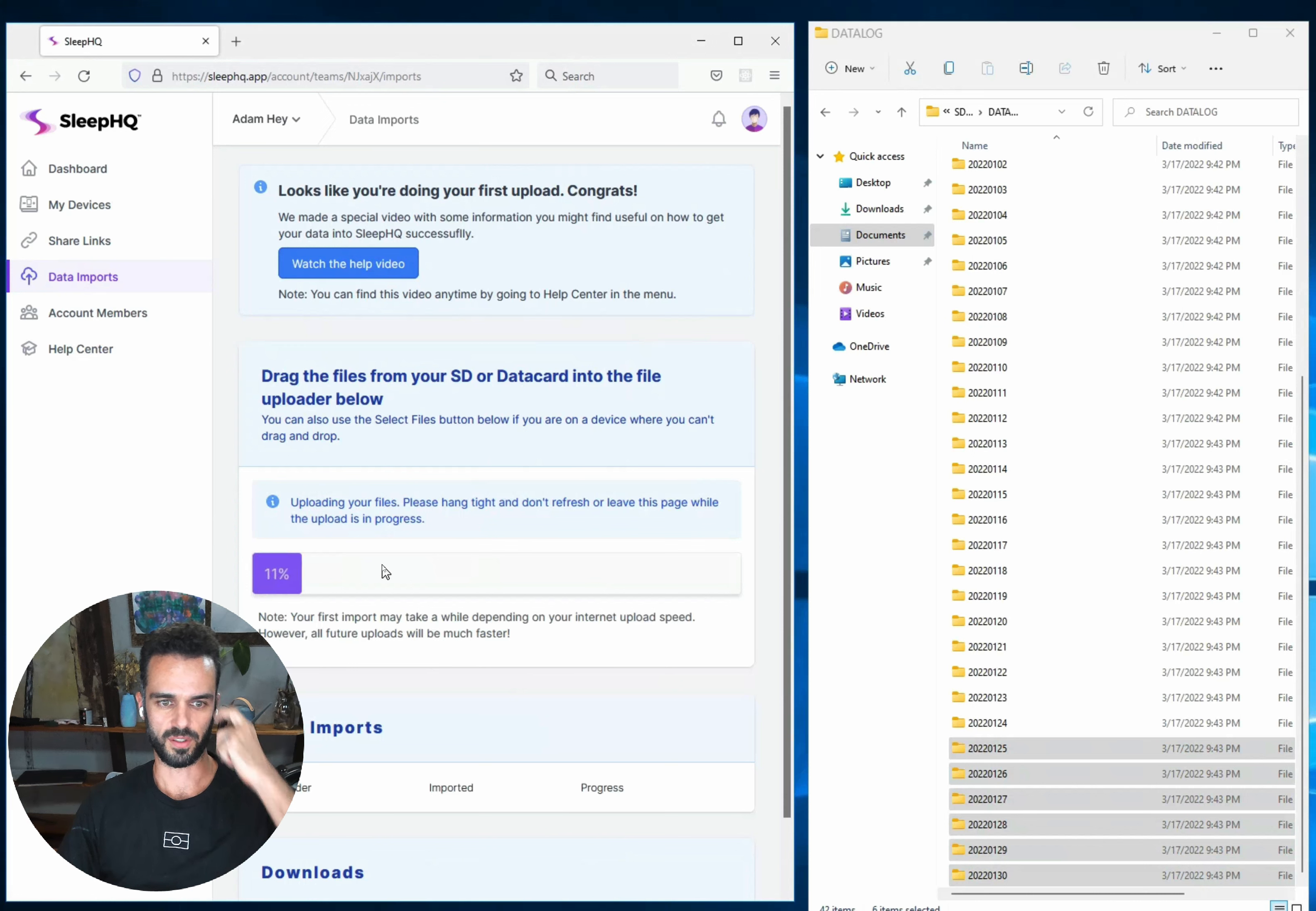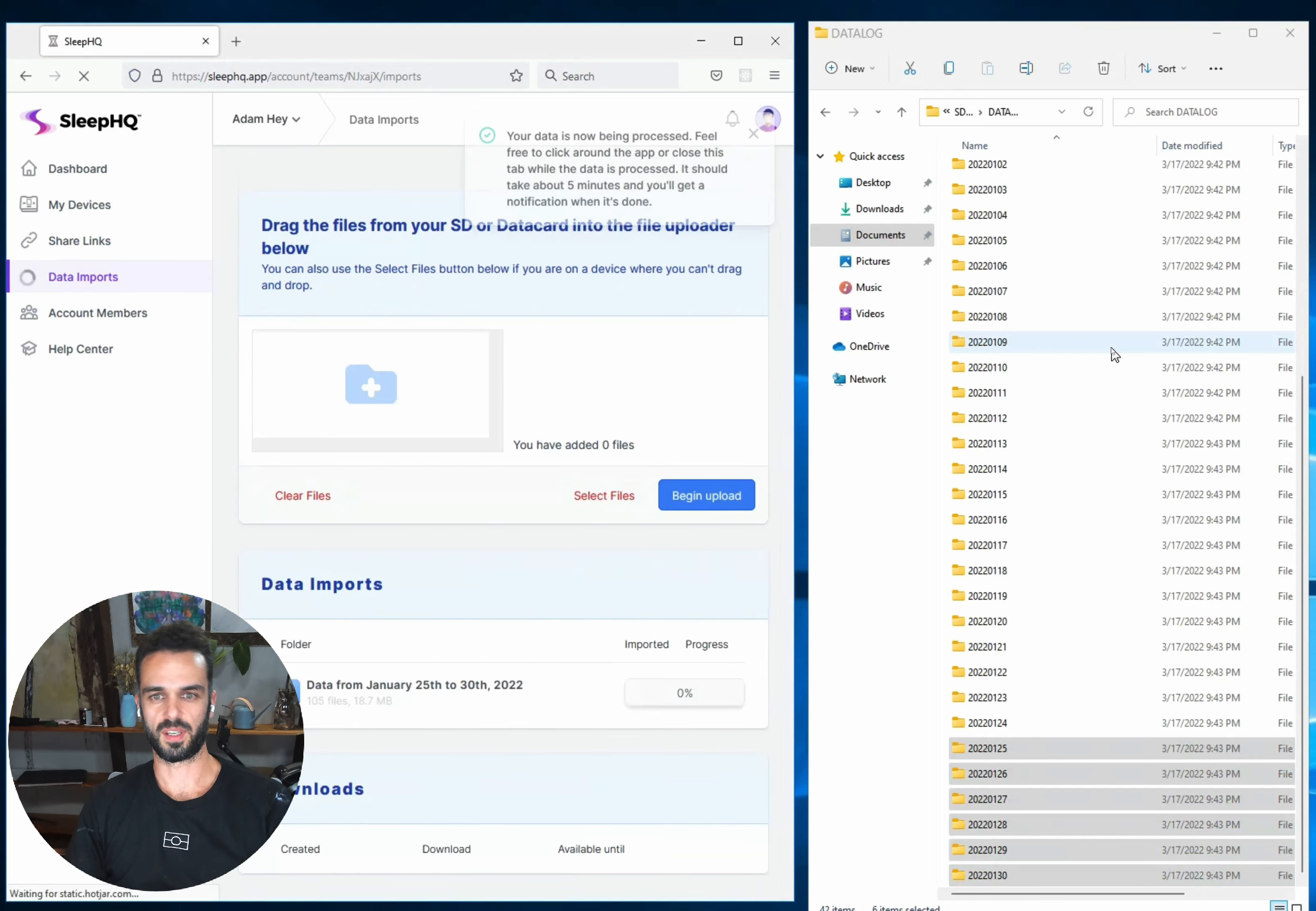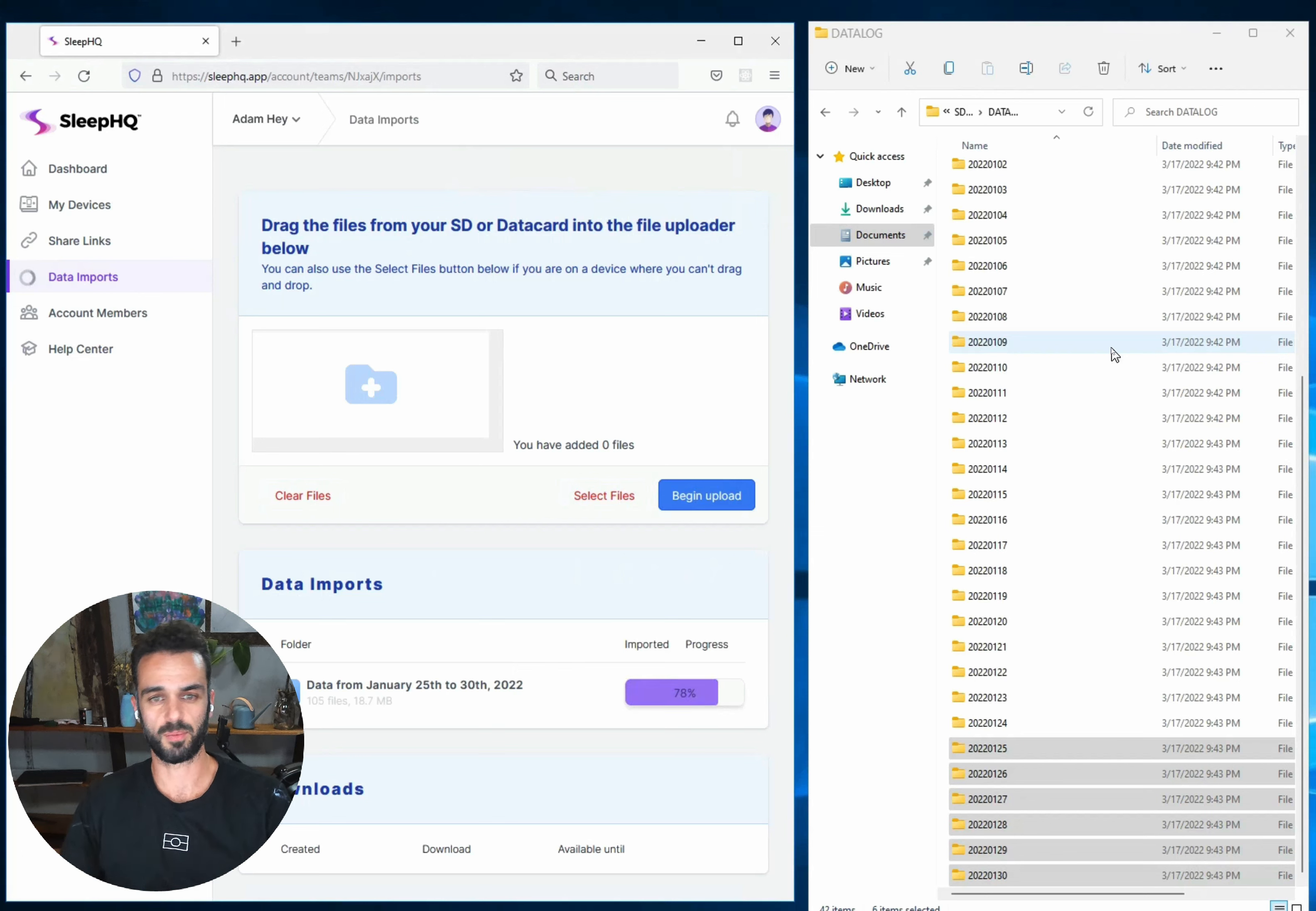And those 105 files that I selected are now being uploaded. Now I can do as many chunks as I need to to get all my data in. I would recommend starting small, starting with 5, 10 days worth of data at a time, and then expand out as you get more comfortable with the process. I've been finding I can do about six months worth of data pretty comfortably on most internet connections with most machines. But again, it depends on the power of your computer. If your computer doesn't have a lot of memory, it might be that it can only handle doing smaller chunks of files. So start small and build up and then you're going to have the best success.